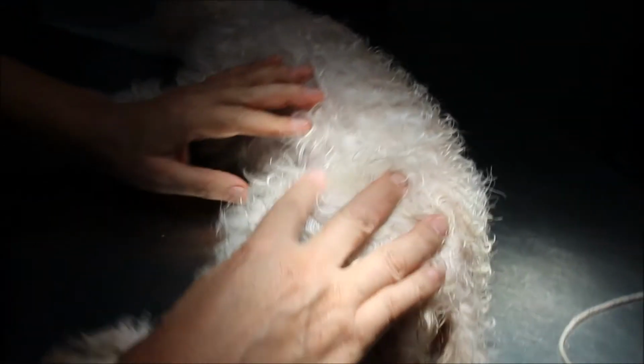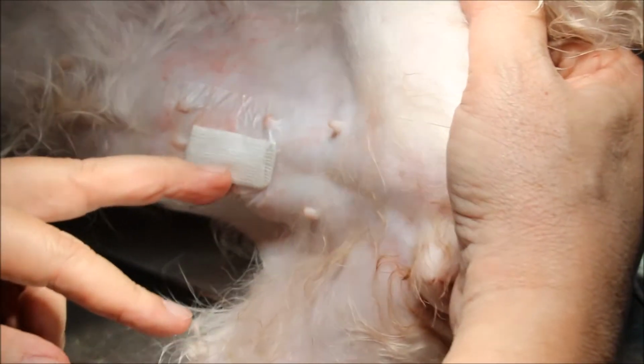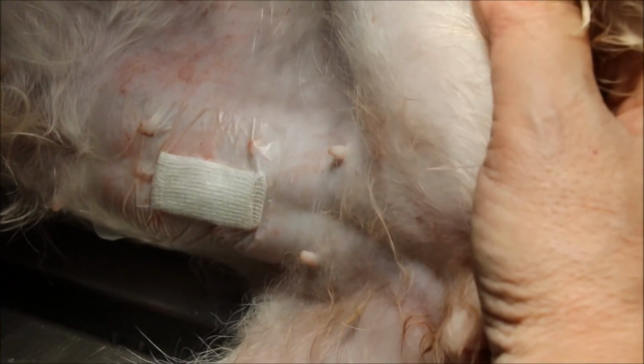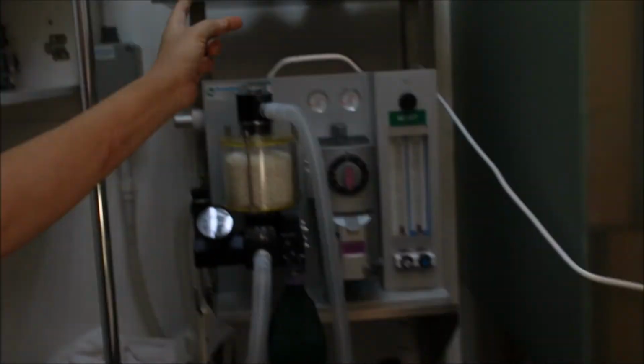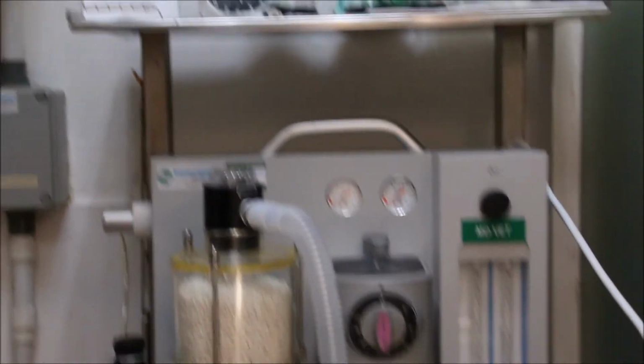The other thing is this suture inside is absorbable, so the owner doesn't have to come back for stitch removal. There's an advantage for the owner. Now I'm going to give the antidote. It's called Antisedan. Now you can see the time, 5:42. Within 5 minutes, the dog should be awake already. So you see, I'm going to give it IM.